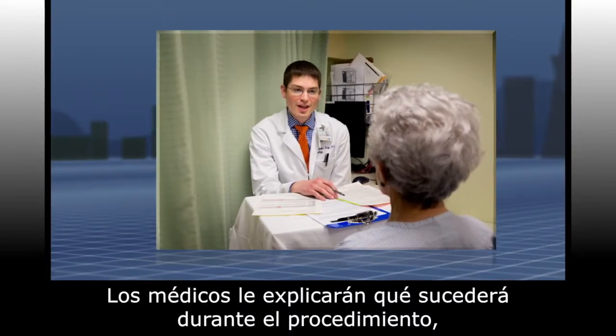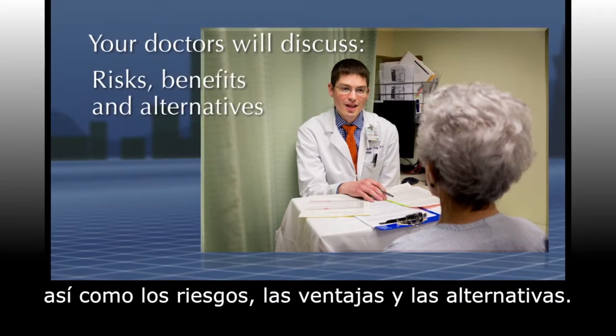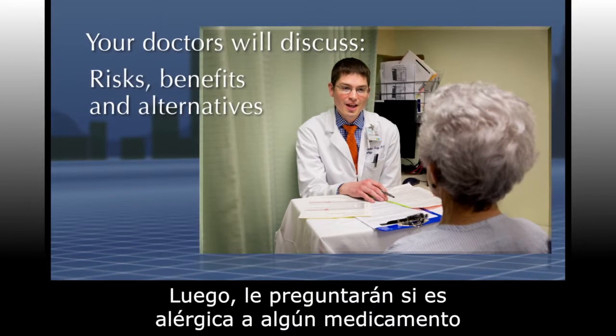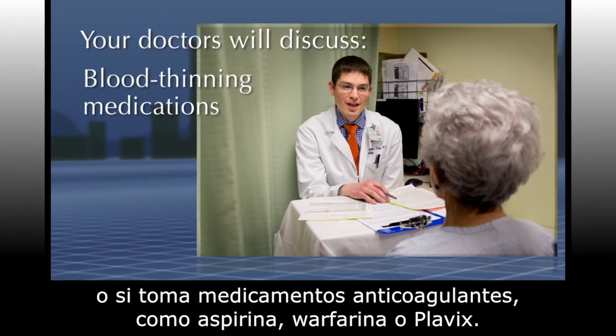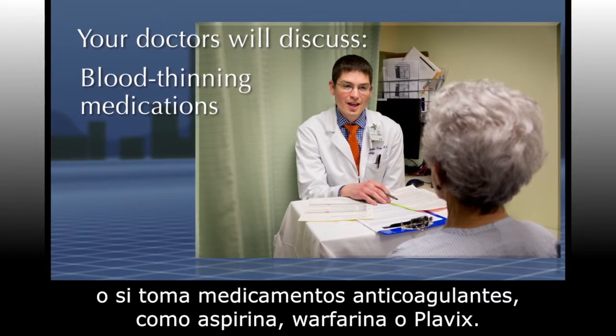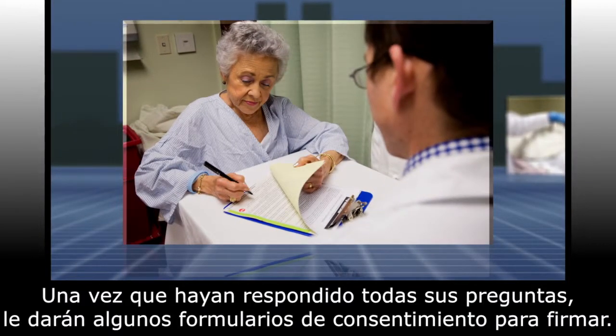Your doctors will explain what will happen during the procedure as well as the risks, benefits, and alternatives. They will ask you about any medical allergies you have or blood thinning medications that you take, such as aspirin, Warfarin, or Plavix. Once all your questions have been answered, you will be given a few consent forms to sign.